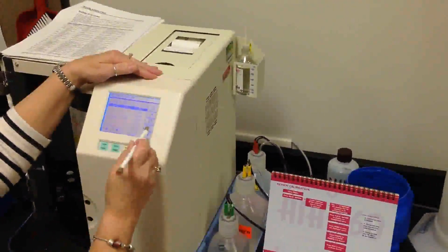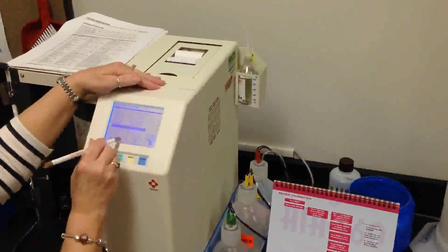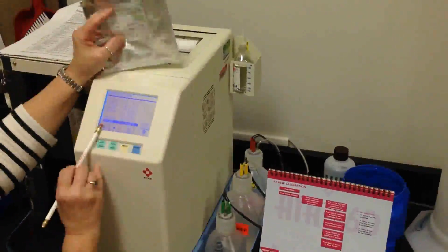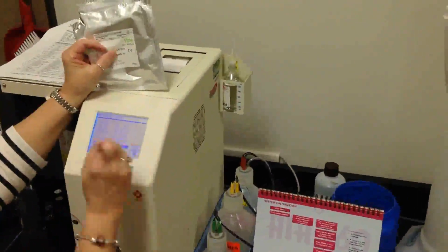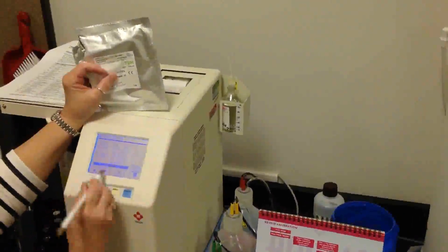and go to Calibration Review and find my TSH using my arrows page down. This is lot 72. Lot 72. Let's go down one more. Okay, I got several in here.